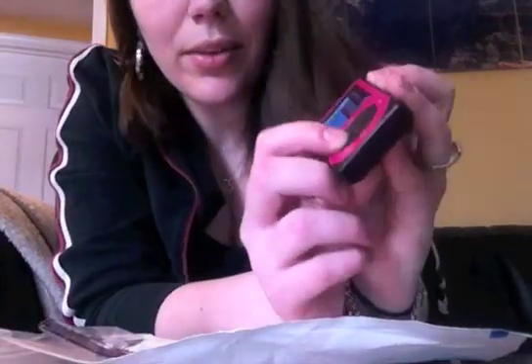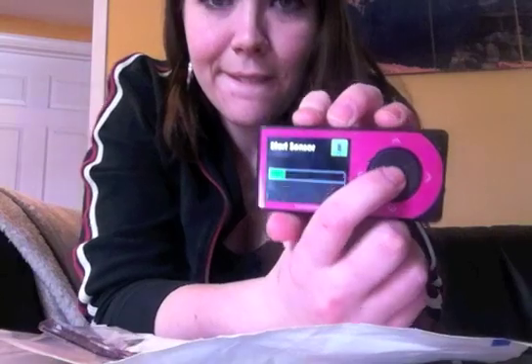Now we need to tell the device that we want to start a new sensor. It's now reading wirelessly. You have to wait about three hours for it to prompt you to put in blood sugar readings to find a good baseline level. I suggest doing the calibration when your blood sugar is at a steady pace.